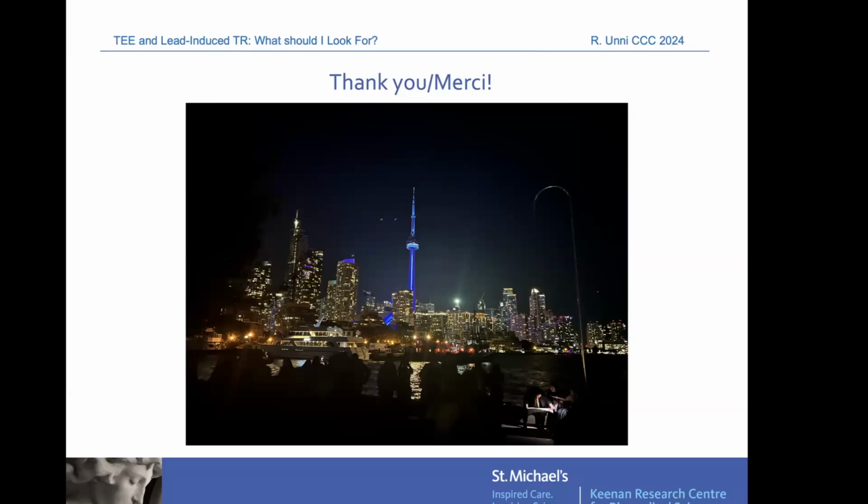That's a good question. Should everyone just get a Micra? I think cost is one thing. I think durability is another question. And the third is, interestingly, there are some studies looking at the development of TR after Micra insertion. There are definitely reports out there. It's not a tiny device. It still is about the size of a battery, and it can still interfere with the chordae. It's a good question.